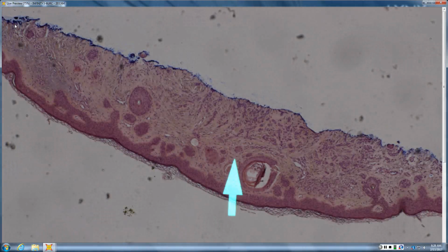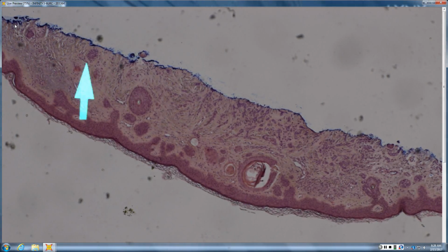It looks like it must be a piece of desmoplastic trichoepithelioma or MAC. So very good. You see a paisley type pattern with horn cysts. So you said desmoplastic trichoepithelioma, microcystic adnexal carcinoma, morpheoform BCC, or syringoma, depending on history. This is sun-damaged skin, so syringoma becomes less likely. Actually, desmoplastic trichoepithelioma becomes less likely, and now you're more worried about morpheoform BCC or MAC. Okay.